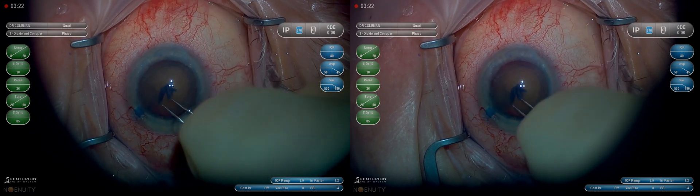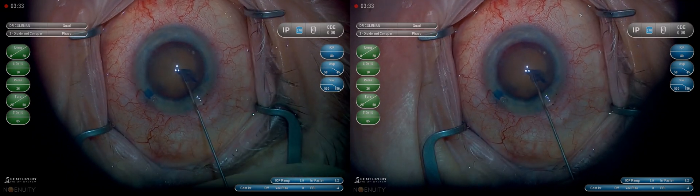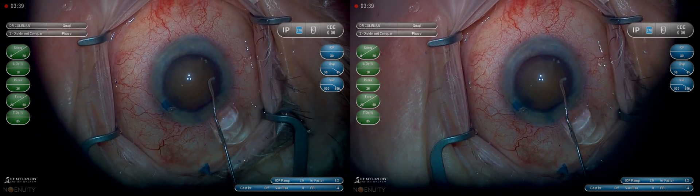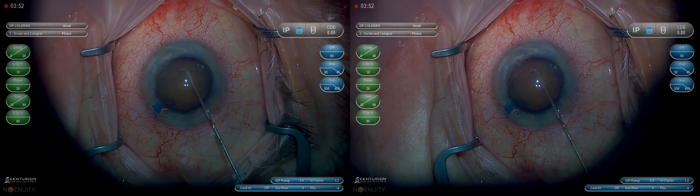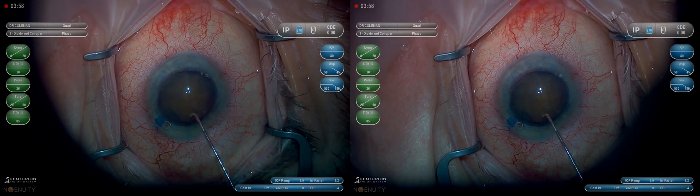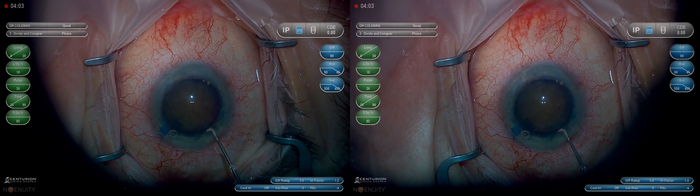I think that helps bring a dense lens into the anterior chamber slightly easier. Some people say do not hydrodissect a mature cataract, but I think it is safe if you use very low pressure and very low volume — it's a low flow situation. If you create high pressure you are at risk of blowing out the posterior capsule before the nucleus is removed. So if you're going to do it, do it carefully, but I do think it helps get the lasso around the lens when you use the MyLoop.